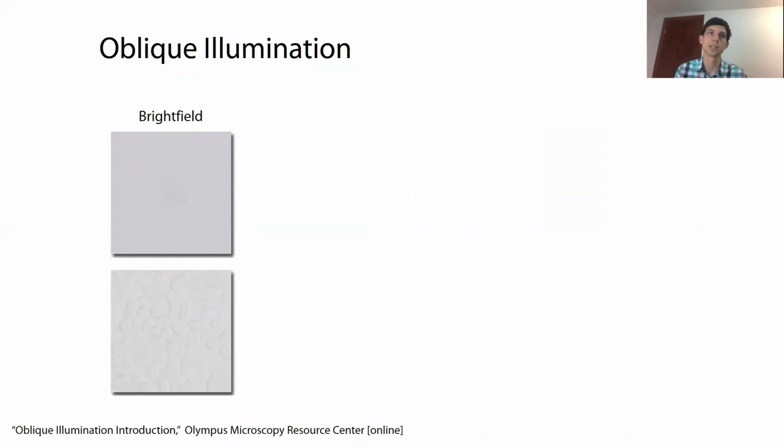However, the healthy cornea is normally transparent. In microscopy, we would call this a phase-only object. That's to say, it does not absorb or fluoresce significantly. The only change of the light wave that happens as it passes through the sample is a change in the optical phase. And unfortunately, current detectors are far too slow to measure the phase of light waves, and they basically only measure intensity. Thus, a transparent object like cells on a plate, for instance, in these two examples, exhibit very little contrast under bright field illumination.